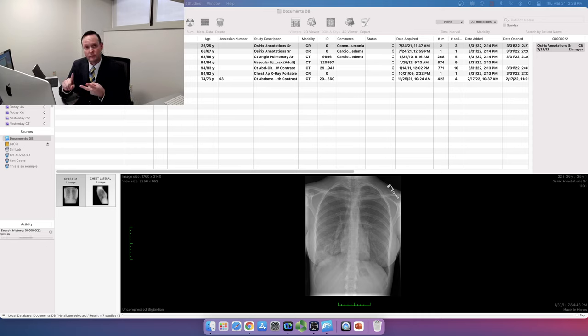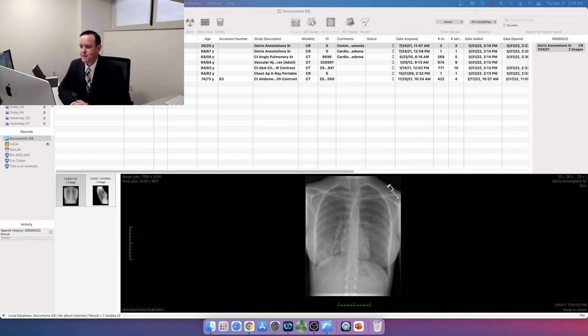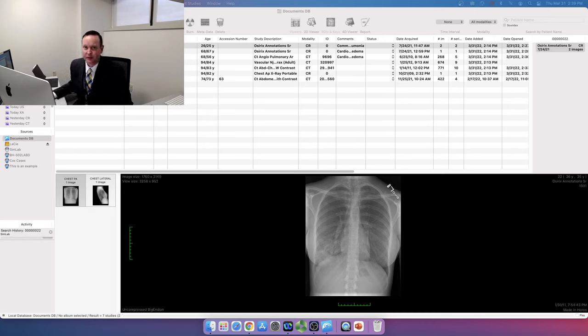Localize, characterize, contextualize. So with that, I'd like to show you a few cases of pulmonary consolidation.